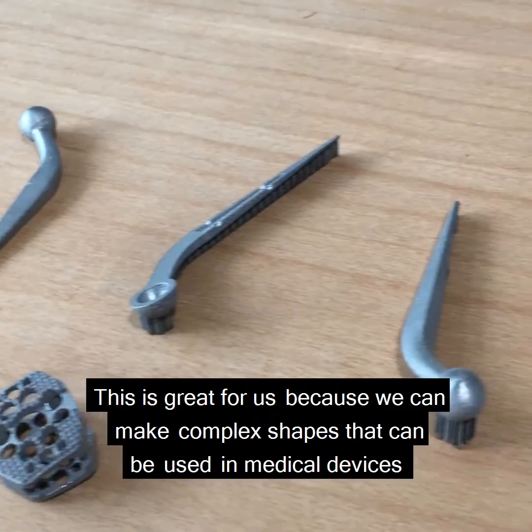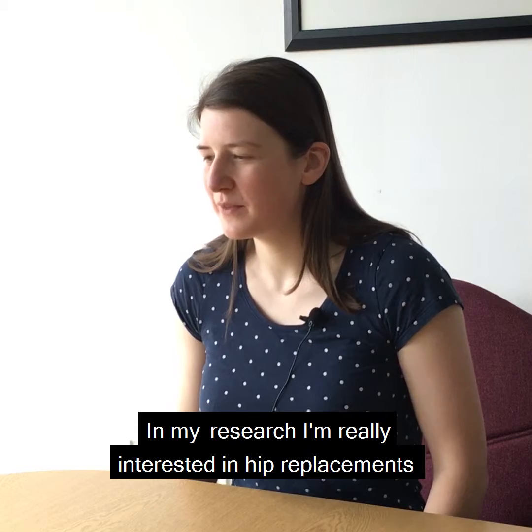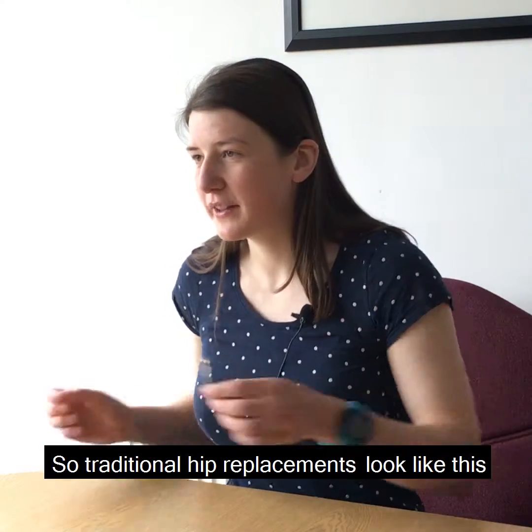This is great for us because we can make complex shapes that can be used in medical devices. In my research, I'm really interested in hip replacements.